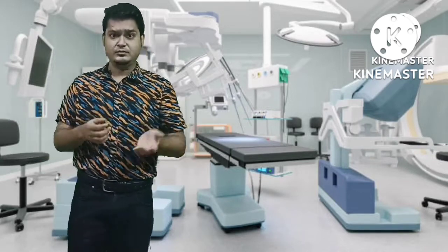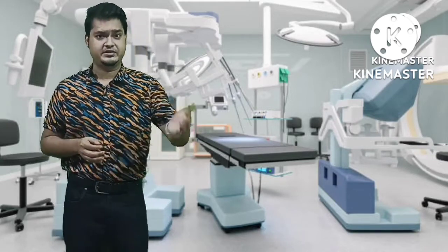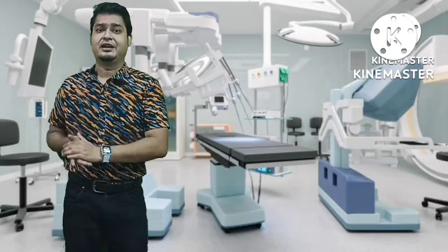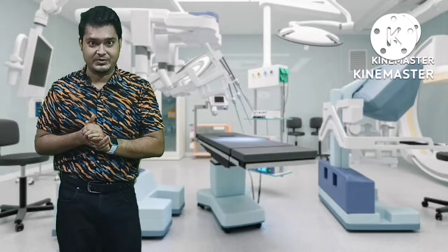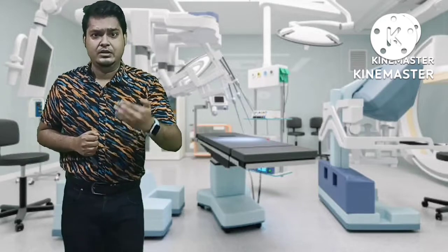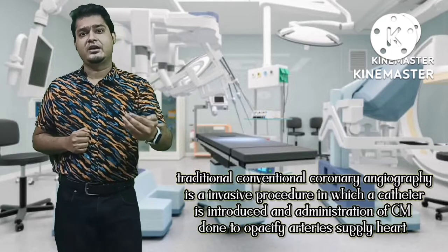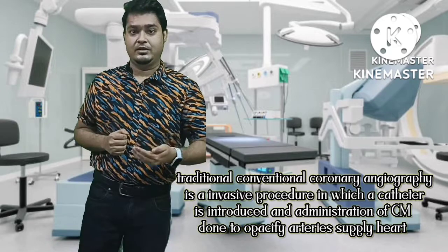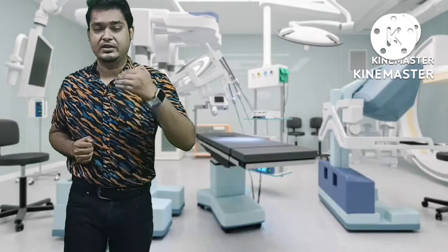Okay, so first of all I will discuss the traditional coronary angiography, then I will come to the advanced and modern CT coronary angiography. Traditional coronary angiography is basically one kind of procedure which is invasive in nature. Why are we saying it is invasive in nature?